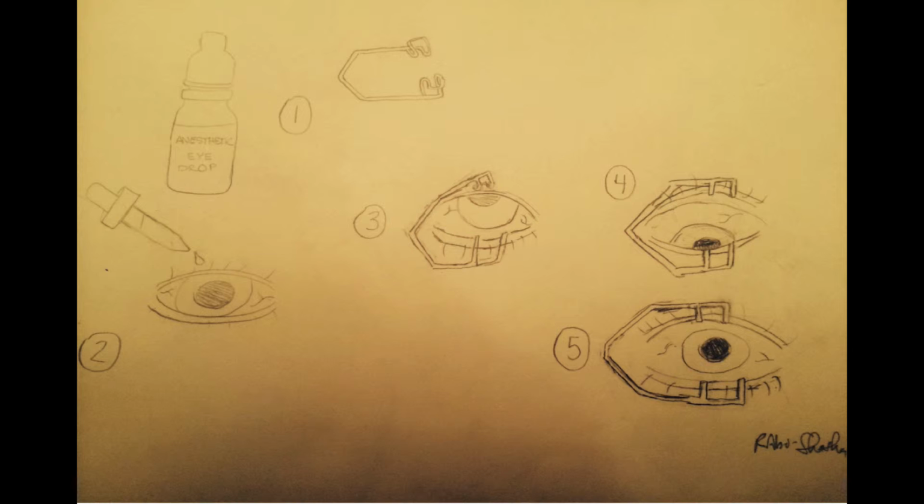Starting in step number 1, it's important that you have all your equipment. This includes the eyelid retractor, as well as an anesthetic eye drop. Eyelid retraction involves putting in a foreign object around the lids, and so it's very important to use an anesthetic eye drop to numb the eye, as depicted in step number 2.